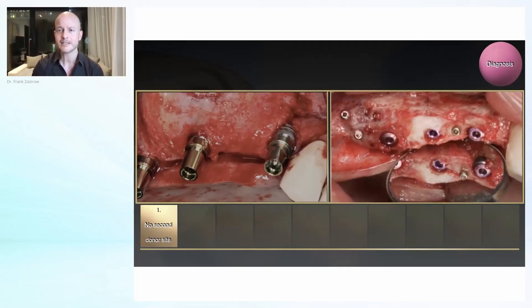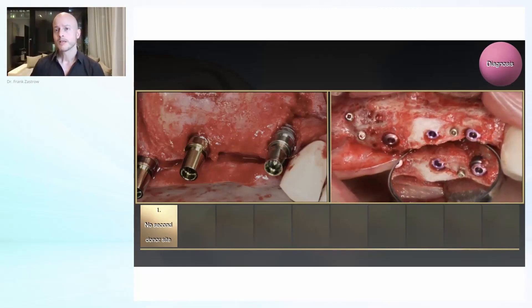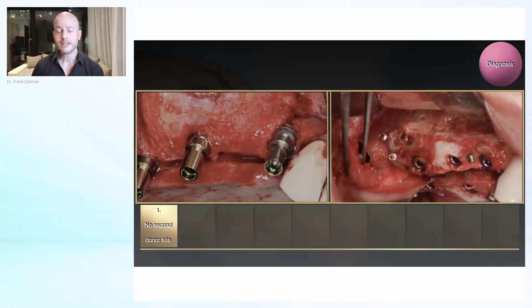This is another case where we built some bone vertically, and then you see here some bone needed to be re-augmented in the palatal area. But instead of going for another block and opening the external oblique line again, we can just easily go to the tuberosity, get some bone from there and use it.